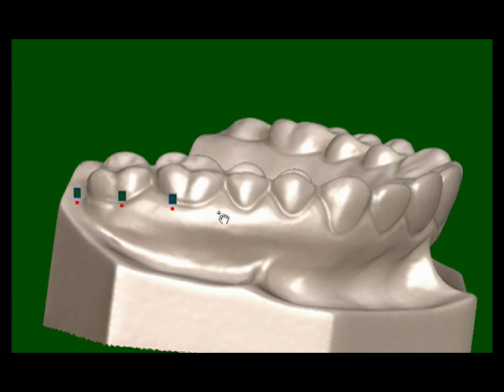The perimeter of the splint is defined by clicking a series of points on the model.